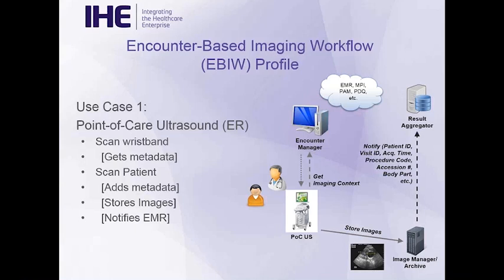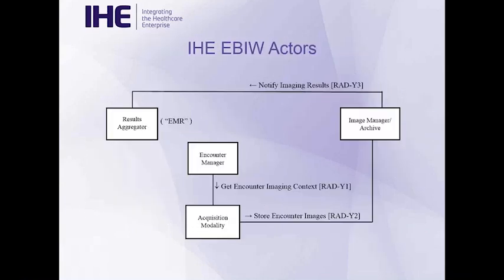And so the notification contains the patient ID, the visit ID, all of the basic details to put an entry into the medical record that there are a set of images, and here are the details about those images. The profile does not require the EMR to create an order in the background, but we recognize that a lot of EMRs prefer to backfill an order even for non-ordered imaging, because that relates to how they do their image management and their billing. And so all of the information is there. If they want to backfill it, they can. The profile doesn't require them to.